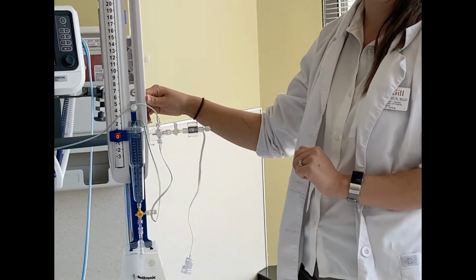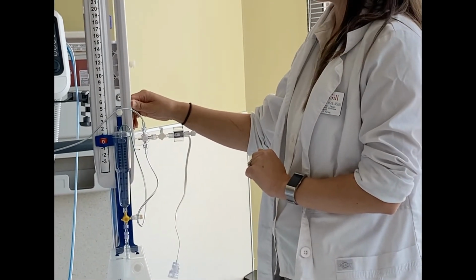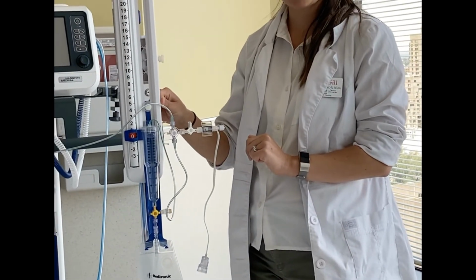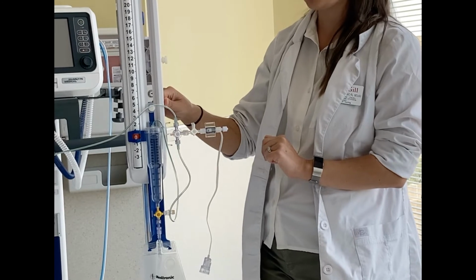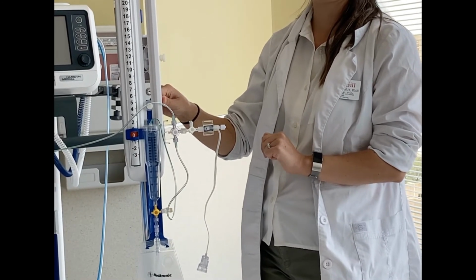So your ICP reading is actually not going to be correct. If you need to measure your intracranial pressure while your patient is on continuous CSF drainage, you need to temporarily stop the drainage and then measure your ICP.